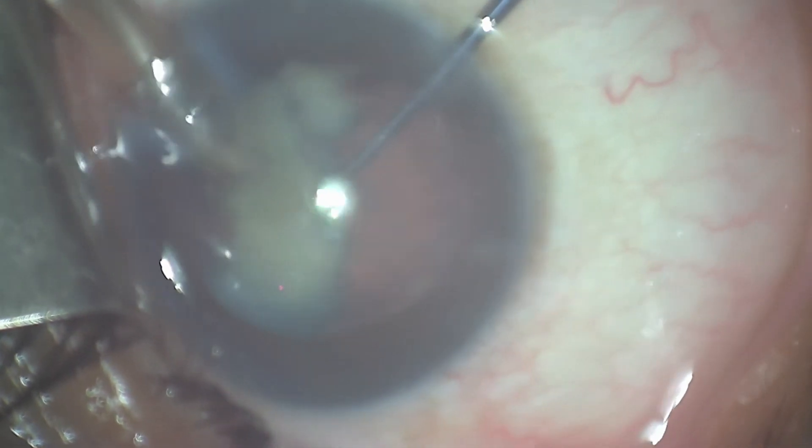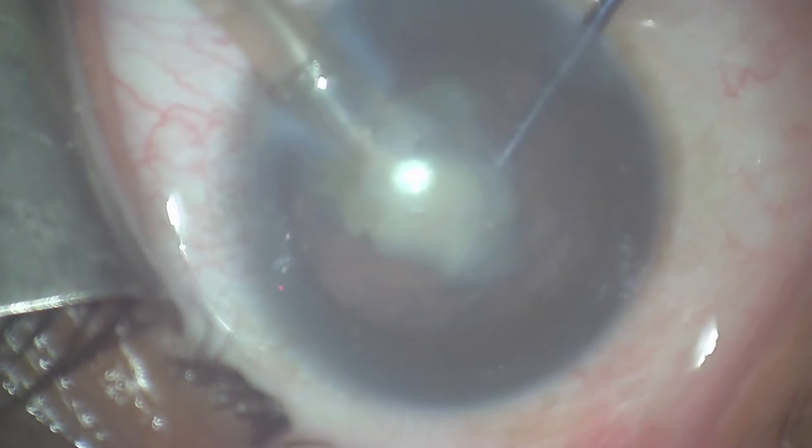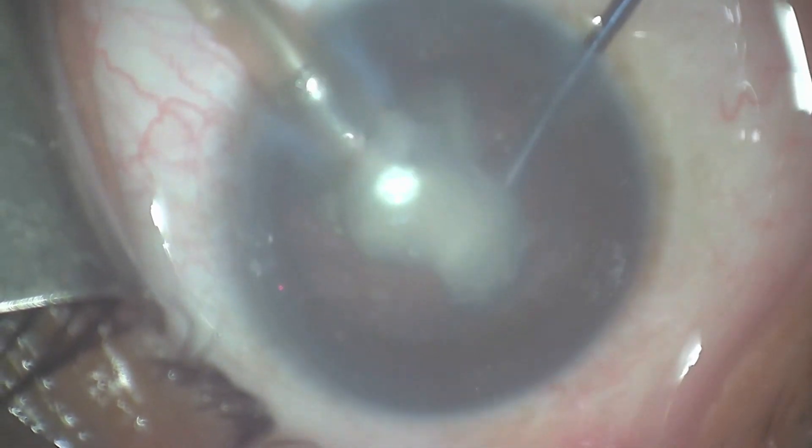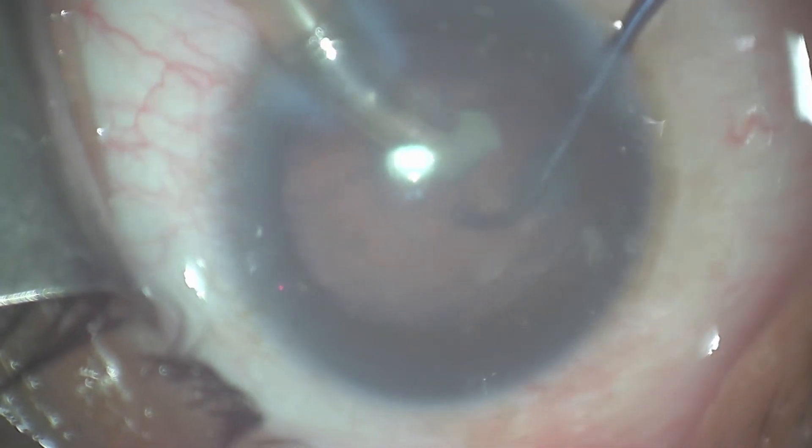Ongoing phacoemulsification takes place here, making sure that we're careful to keep the lens in a safe place so that the lens can ultimately be completely emulsified.